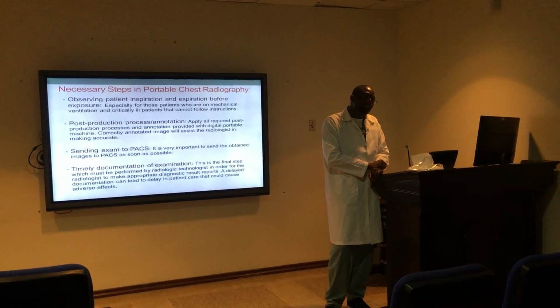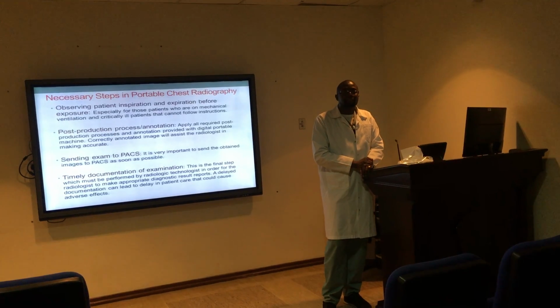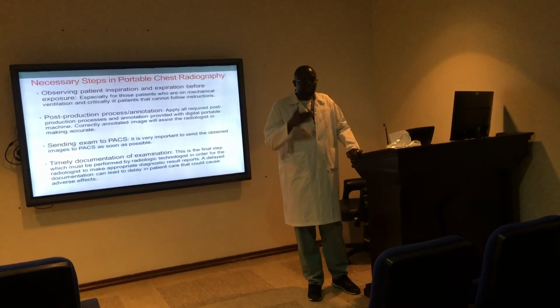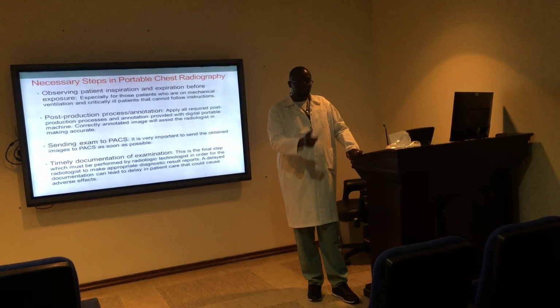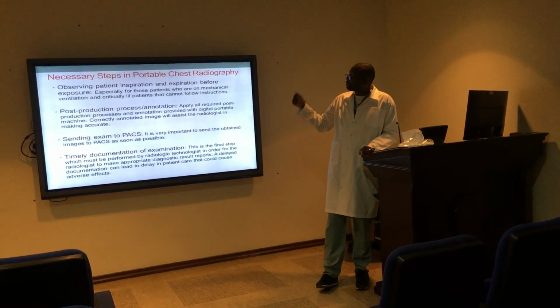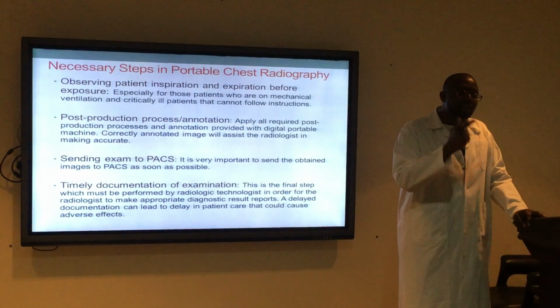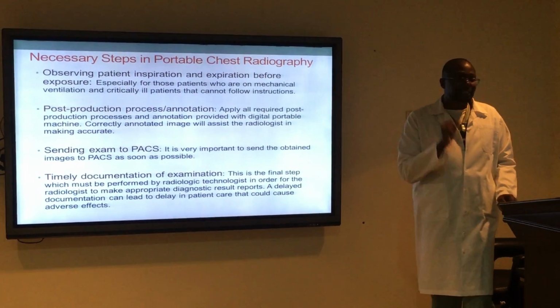We went through this when we were doing the departmental X-ray exam, why we have to give instruction to our patient twice. Take a deep breath in, blow it out, another deep breath in, hold it, then you make your exposure. The same thing could be done on portable. If your patient can follow your instruction, you give the instruction to the patient. If the patient cannot follow the instruction, you have to observe. Very important.